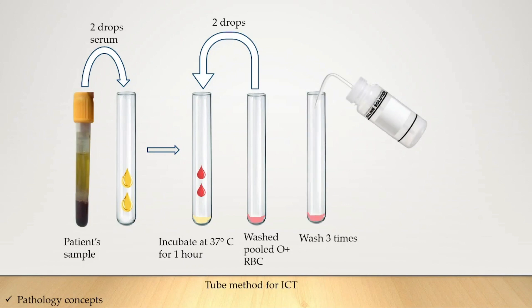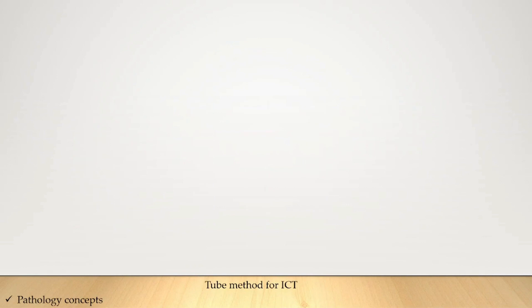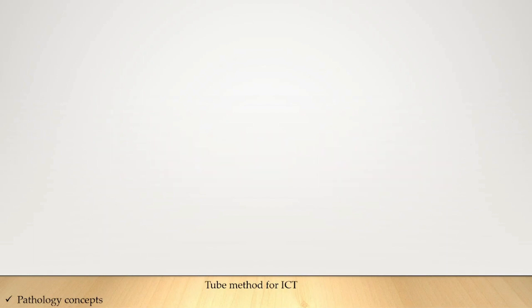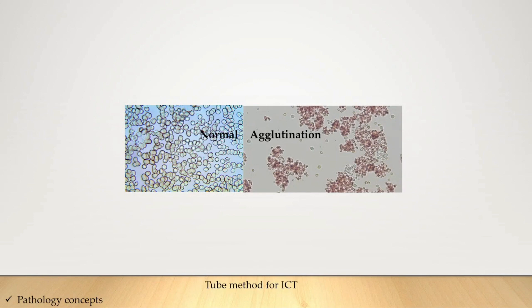After incubation, wash the test tube three times with normal saline. After washing, add anti-human globulin to the test tube and keep for five minutes, then centrifuge for one minute. After one minute, check under the microscope to see the reaction. If no agglutination is seen, ICT is negative; if agglutination is present, ICT is positive.